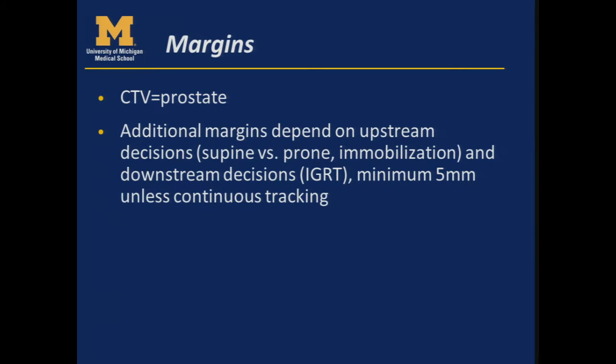So margins, similar side to everything. CTV equals the prostate actually for prostate cancer because there are usually multiple prostate cancers hiding within one person's prostate. So even though for research purposes, sometimes people do whole prostate plus maybe a boost to a nodule, the whole prostate is still typically part of the target. And then the additional margins, again, depend on any other decision that you've already made. So it's very important to have a really integrated system from start to finish.